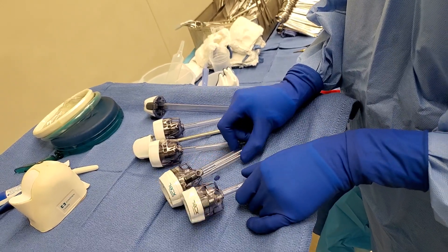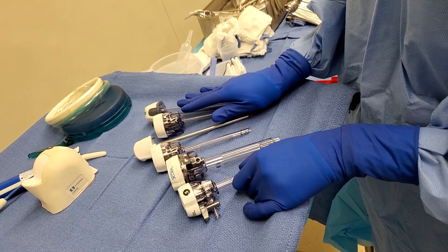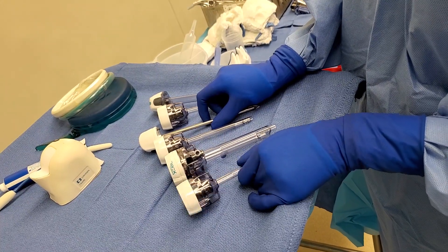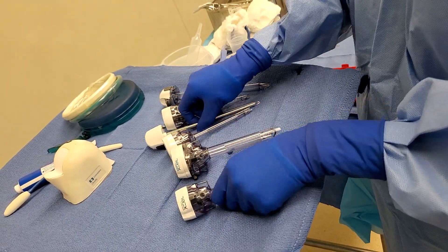These are called trocars. These are used for laparoscopic cases. You cannot go inside the belly without trocars, and they all vary in sizes. For today's case, we're doing a left colectomy, laparoscopic, so we're going to use a 5mm and a 12mm.